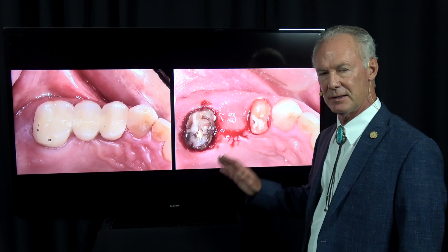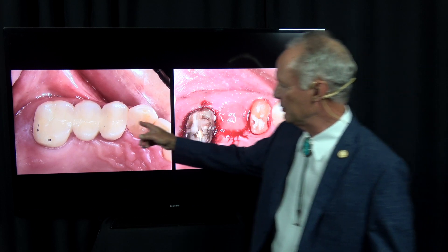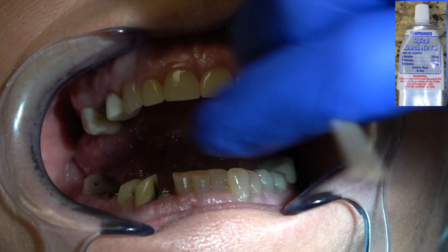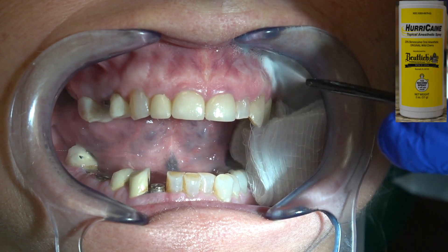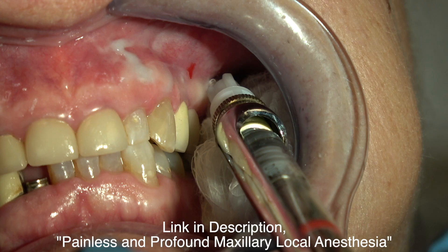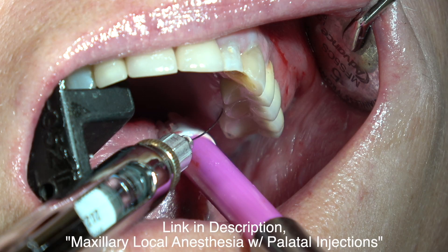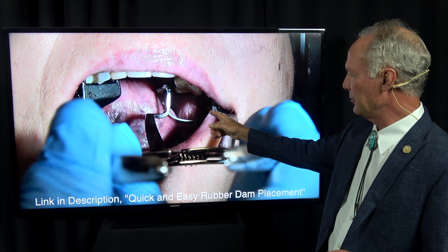This is a basic dental technique but it's very specific: how do you remove an old bridge most effectively? First I'm going to anesthetize the area. This is going to be a very big restoration — we're restoring all the teeth, placing some implants, restoring many of the mandibular teeth. But in this particular video we're only going to be removing the bridge in the upper posterior.